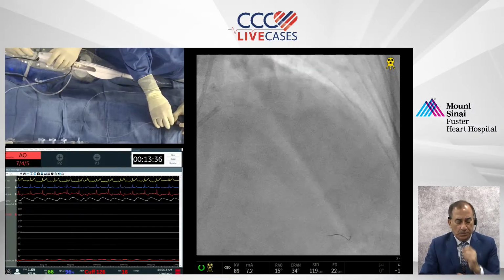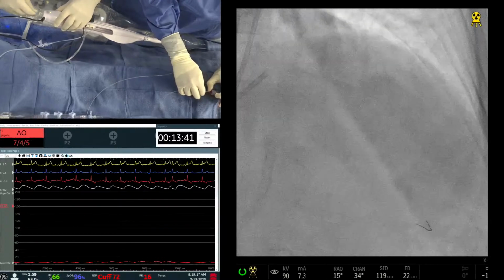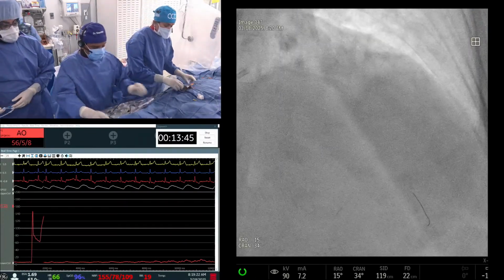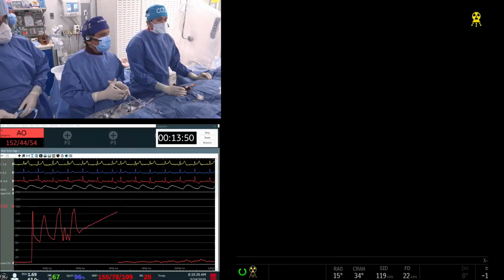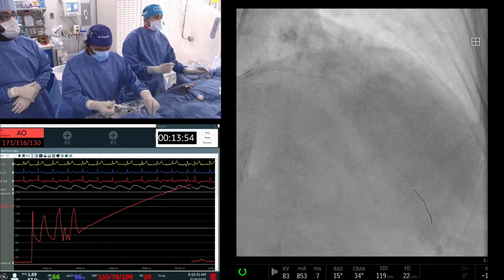1.5? Yeah, we'll do it. Then why do you want to run through the wire here? So let's stop it. Good. Let's take a picture and then we go to the D1. And I think clearly the 1.5 was a very good choice.